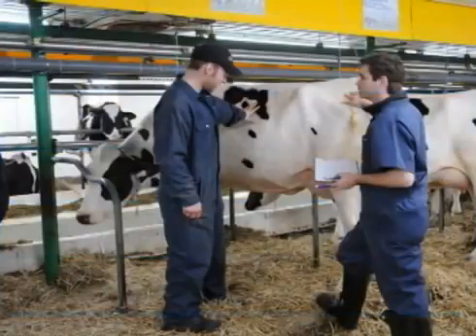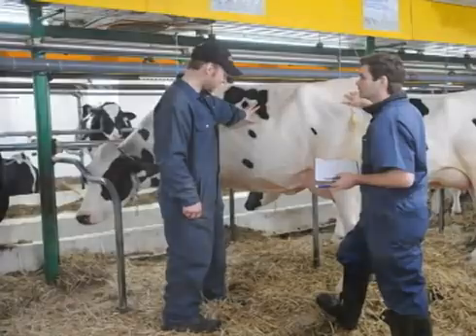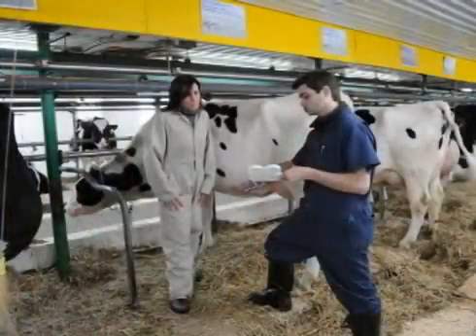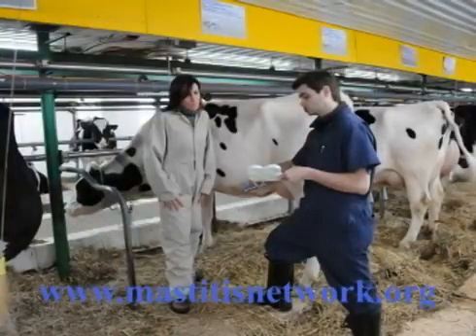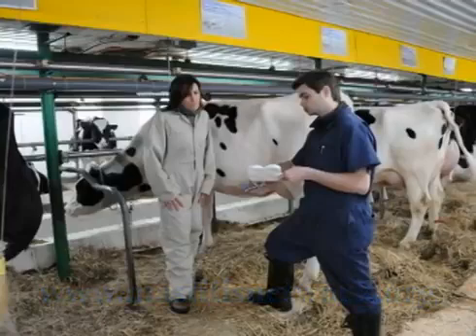The CMT may be used in different situations. First, to verify the health status of a cow you wish to purchase. Second, to identify specific quarters for further testing and possible treatment when a cow has a high somatic cell count. Finally, to detect the presence of subclinical infections at the beginning of or during lactation as part of an udder health management program. For more information, please consult your veterinarian.